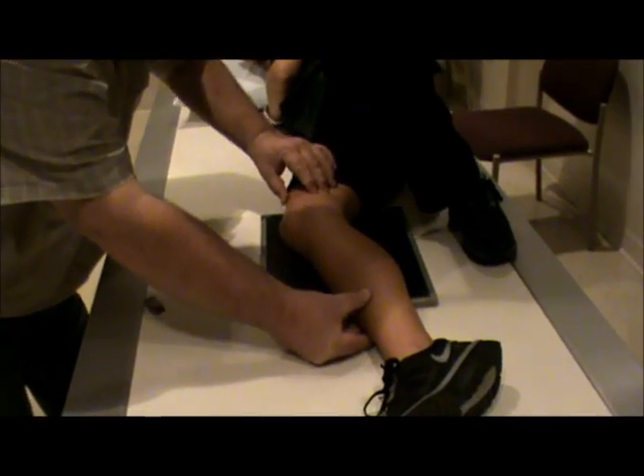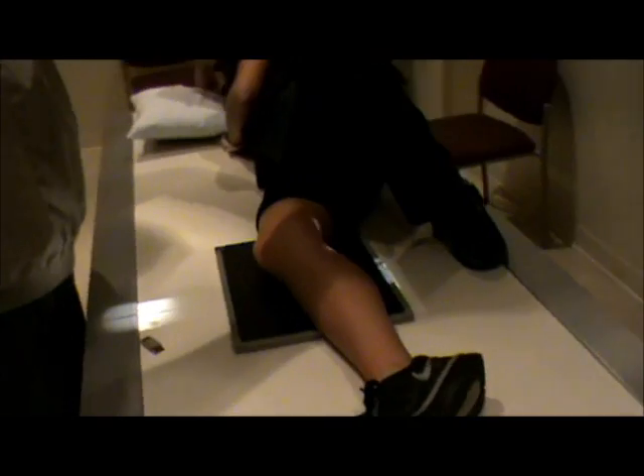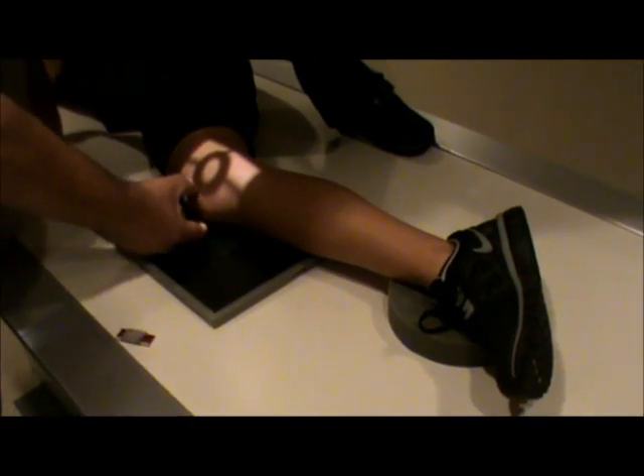It's only a slight flexion. Our centering is going to be approximately a half inch to an inch in from the outer part of the patella — that mid-patella. We're going to adjust our film to be centered both ways. You can slightly palpate it, without injuring the patient, to make sure that it is perpendicular. We can put the sponge under the ankle to keep it in that position. We're now in a true lateral position, at mid-patella, and we should be approximately in the joint space. Marker placement will be in the light field but not obstructing any anatomy.